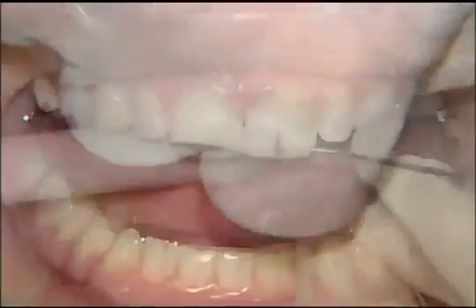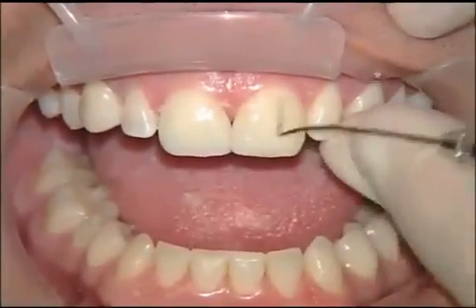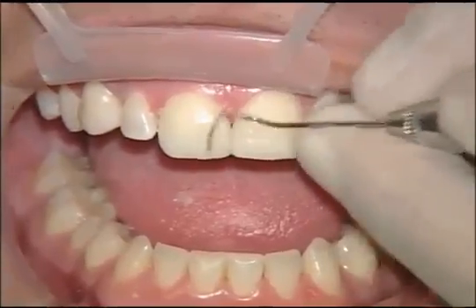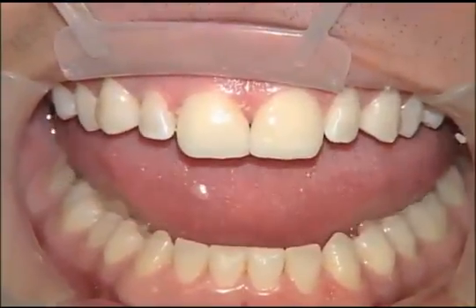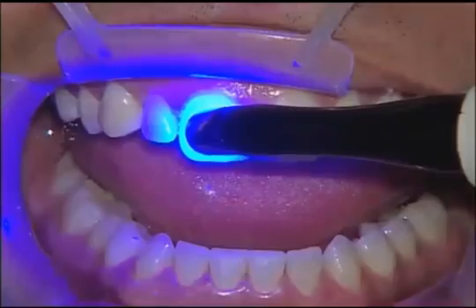And that's one of the things I like about Ensure is the fact that we are able to cure in one spot and not necessarily cure adjacent cement. And as you saw, we were able to work the floss in between the two teeth. It wasn't too tough on the distals because we did have some pre-existing diastema. Once we've cleaned up the interproximal cement and the facial and the lingual cement, we're going to go ahead and do a full cure on these two teeth.